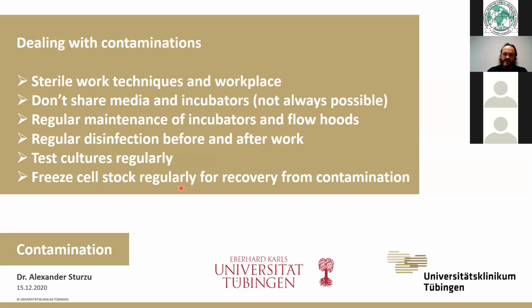How do we deal with contamination? Important is that we keep our workplace and our work techniques sterile. Don't be careless. Then use your own media, don't share them with your colleagues, because then you are the only possible source of contamination. Incubators, I know this is not always possible if you have a lot of people working in the same facilities, but ideally you should have your own incubator. With the incubators as well as with the flow hoods, it's important to have them maintained regularly, and also your work area, your incubator and your microscope should be regularly disinfected.